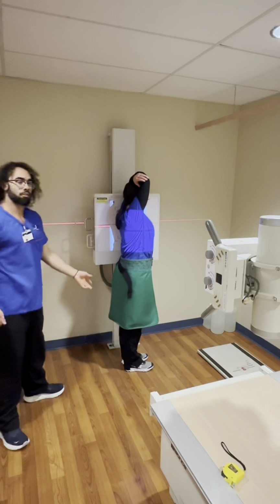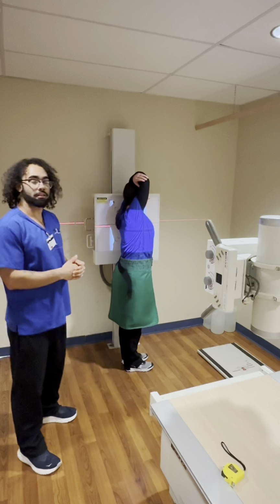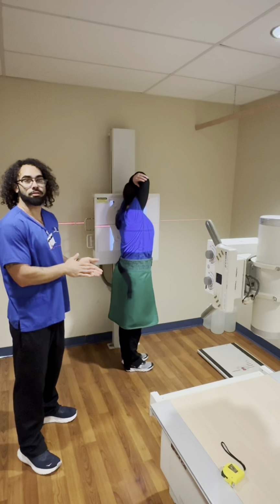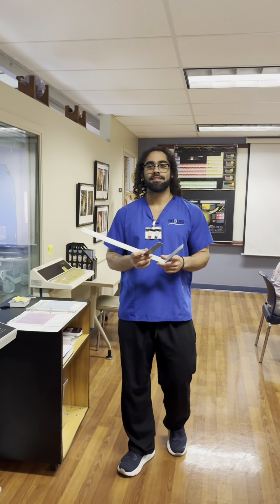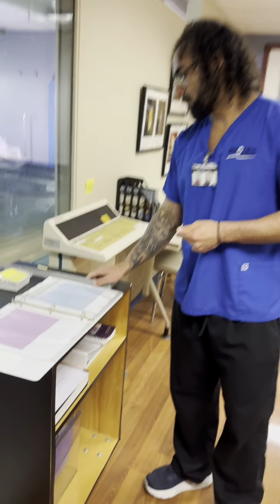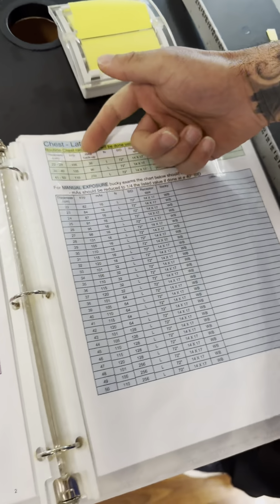Of course, the shield's still on, and then same breathing instructions here. You're going to take a deep breath in, blow it all out, take another one in, and hold it in for the exposure. For the lateral, not much changes here. After you measure your patient, you're going to come back to your exposure book. You're going to see where the thickness lies, and you're going to enter your exposure factors into the control panel.